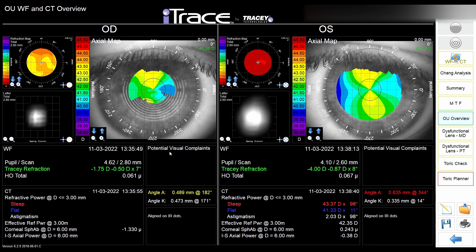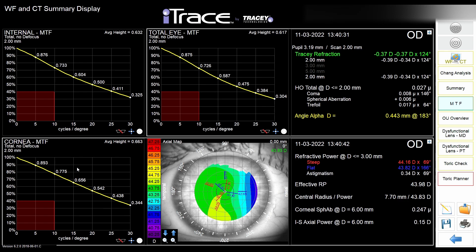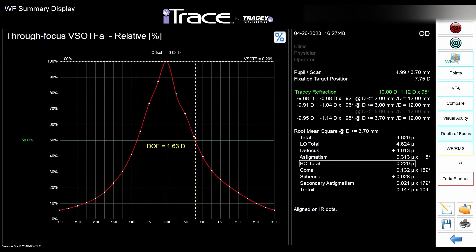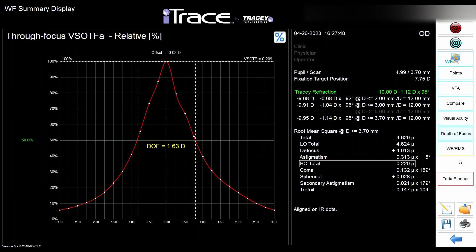With spherical correction, the patient is going to be very happy. On the other side, a good candidate for premium IOL — even without glasses his vision falls outside the danger zone, and adding spherical correction makes his vision far better. There's also a depth of focus curve: the red dots are the patient's focus, the yellow bars show the range of vision between minus one and plus one diopter, and everything above the green line is in focus.